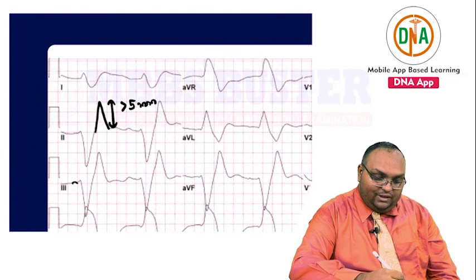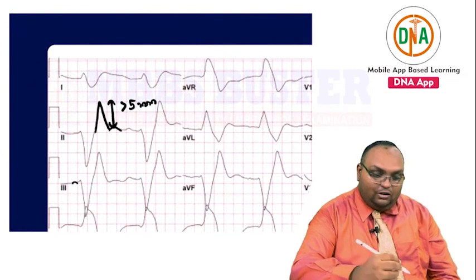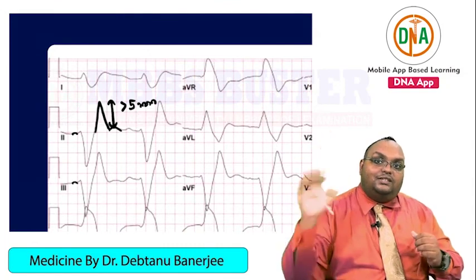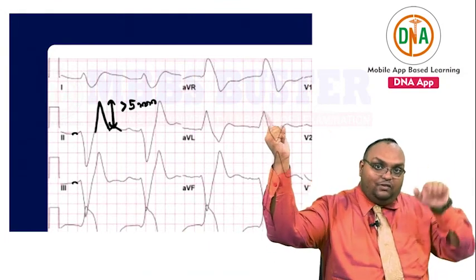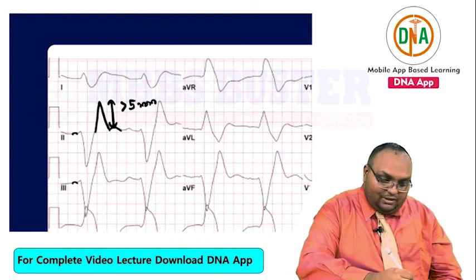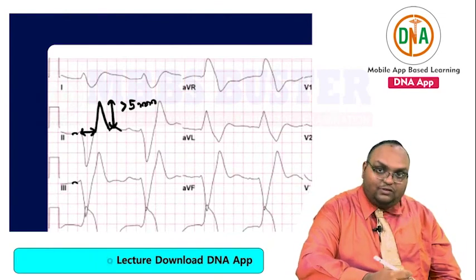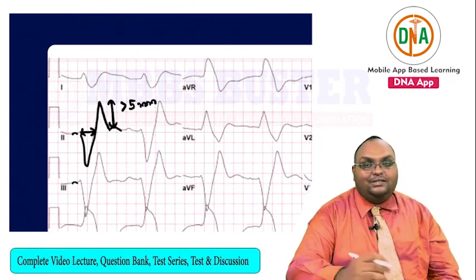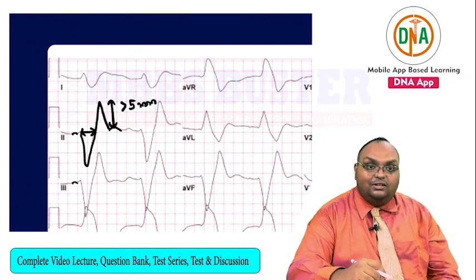Sometimes you might be having an accompanying ST elevation alongside very small P waves, and the T wave is rising, it's pulling up the ST along with it, the P wave is becoming short, and in the tug of war, the QRS complex is becoming wide. This is definitely more than 2 to 2.5 small squares, it's almost 10 small squares. So your wide complex QRS, even if it be only via the S, right?